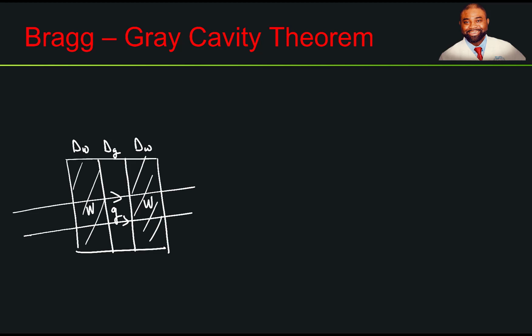One, the thickness of the layer G must be small enough in comparison to the range of the charged particles striking it.